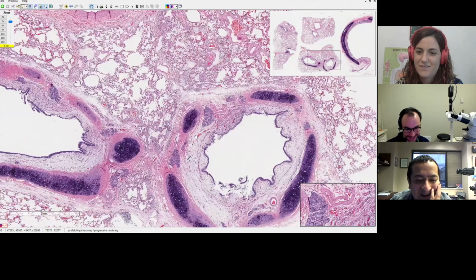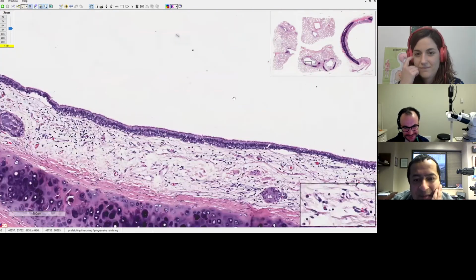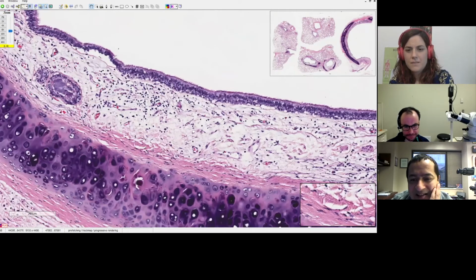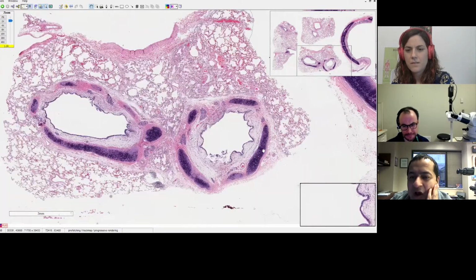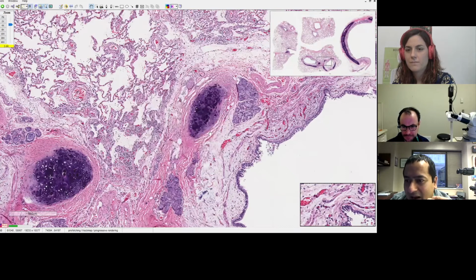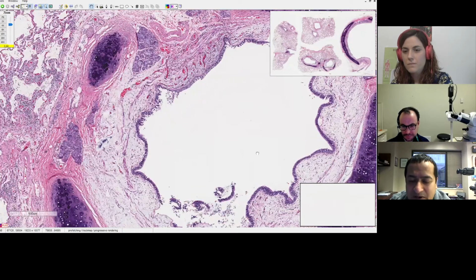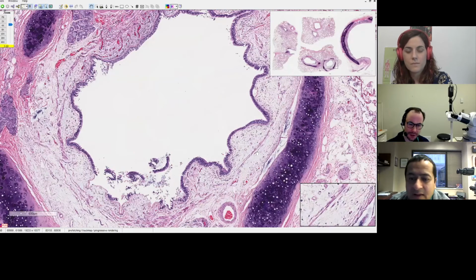One thing I wanted to point out here is that the mucosa is really edematous in this particular case. Agree. Especially at low power, you can really notice it. Yes, low power is the best. See how kind of juicy the mucosa is? And it is pretty inflamed. Although people have also mentioned that maybe intubation itself causes some degree of mucosal edema, and this patient probably was intubated, not ventilated, but might have been intubated on the way to the hospital. I don't know how far down the bronchi that kind of edema goes, but it's possible.